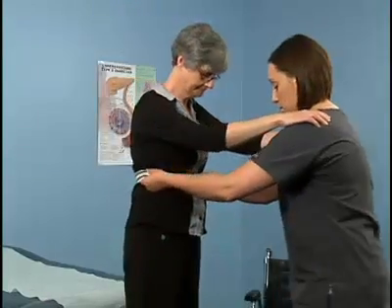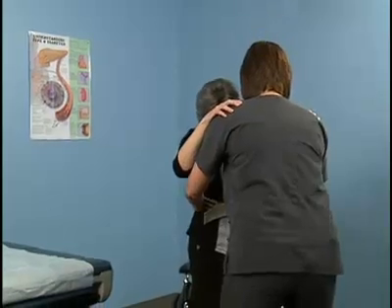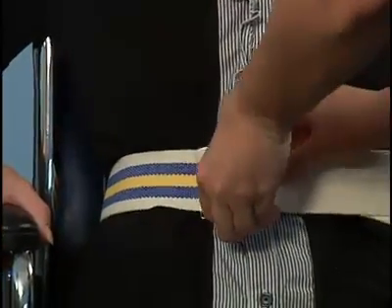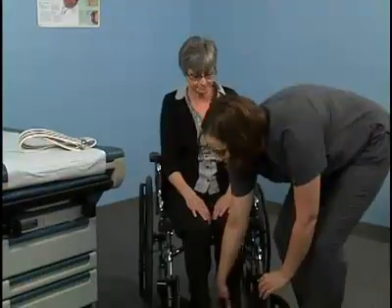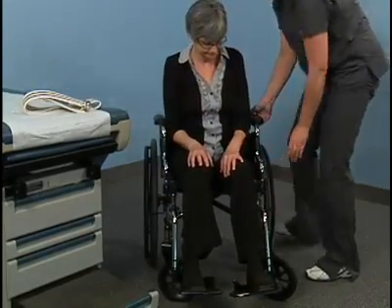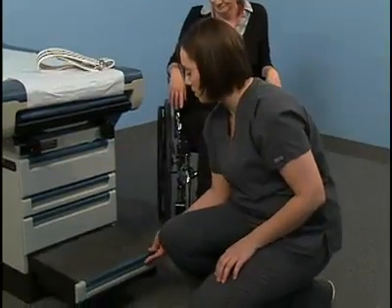Instruct the patient to step down from the footrest, 1 foot at a time. Pivot the patient until the back of the legs are against the seat of the wheelchair. Bend your knees and gradually lower the patient into the wheelchair with the buttocks at the back of the chair. Remove the transfer belt and make sure the patient is comfortable. Reposition the footrests and help the patient place their feet on the footrests and unlock the wheelchair. Push in the footrest of the examining table.